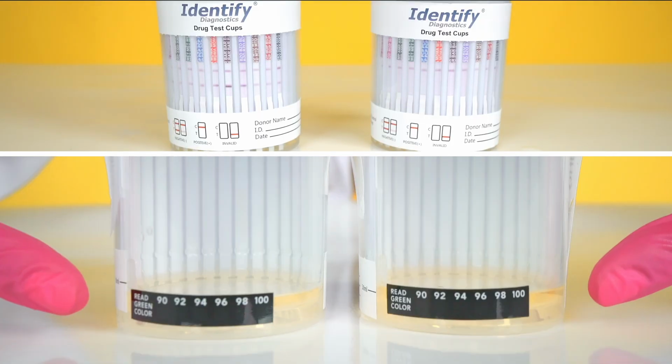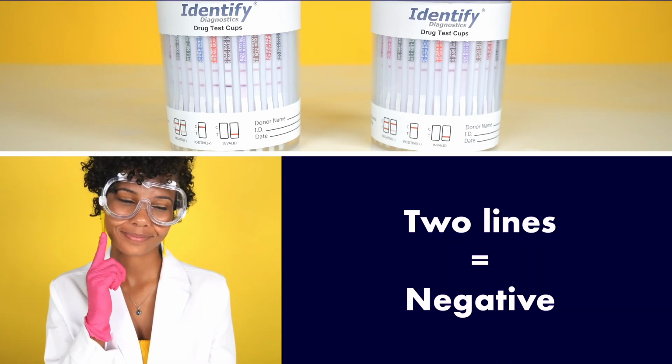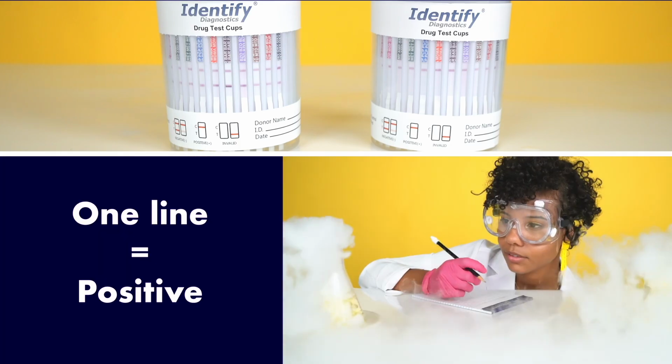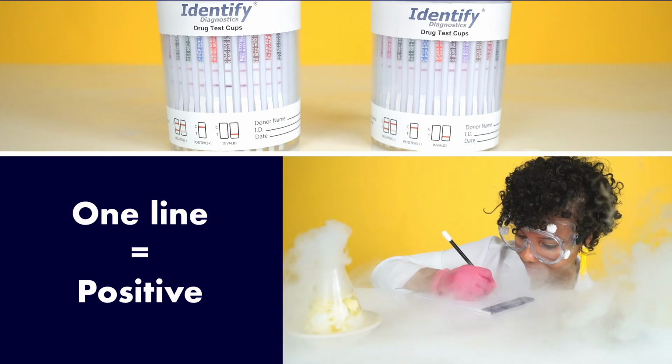In 2 to 4 minutes, verify the temperatures between 90 and 100 degrees Fahrenheit. If you see 2 lines, that means the test is negative. No drugs here. And if there's only 1 line, either a drug has been detected or some food or medication is cross-reacting. And that's it. How very easy.